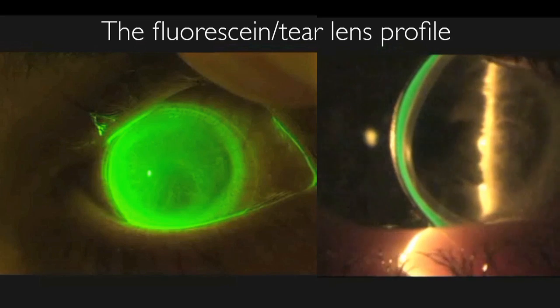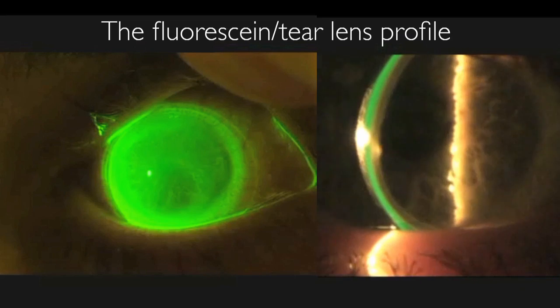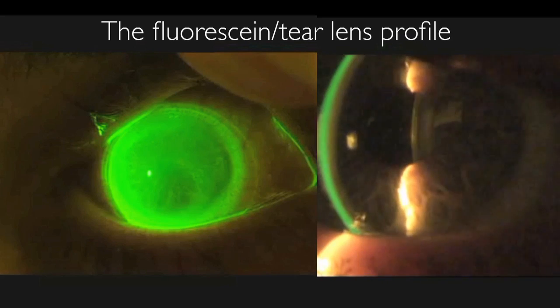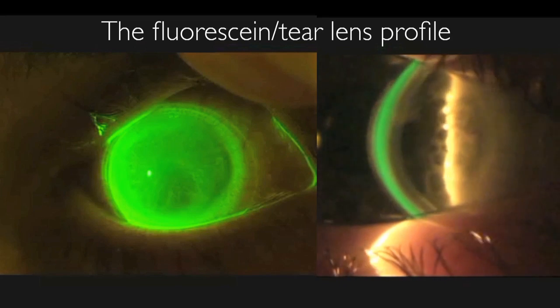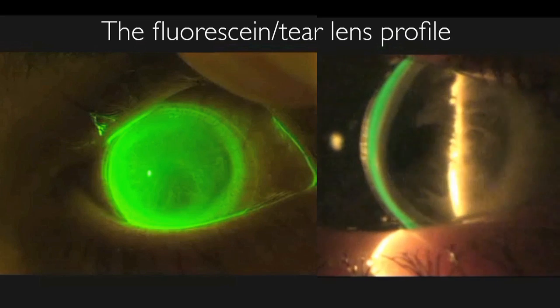I turn the light up to its highest intensity, and with the optic section, I actually look at what is the height of the lens beyond the cornea, and I judge that by looking at the fluid layer in between the lens and the cornea. The lens has a certain depth to it, or a certain thickness, and I can use that as a yardstick to actually predict or to measure the thickness of my tear layer. Both of these fluorescein patterns are useful. The more useful one I find is the optic section.